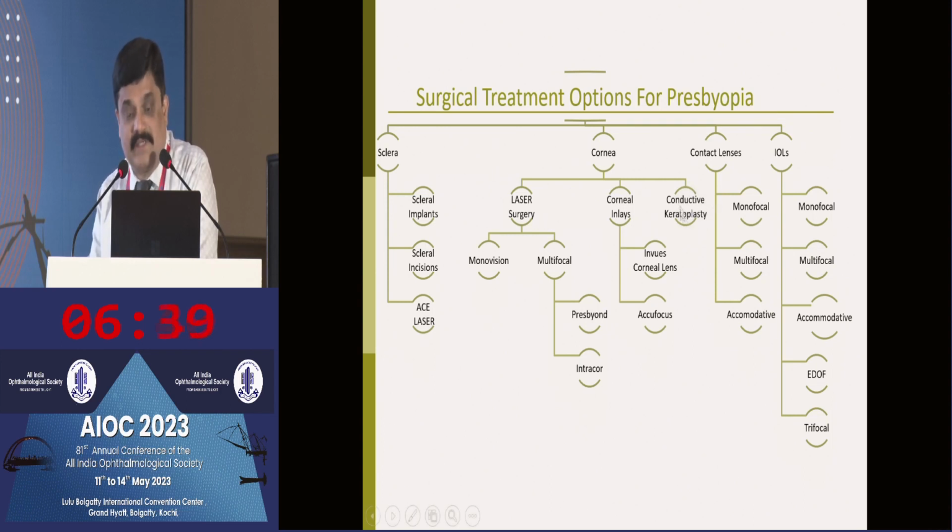People used to do even conductive keratoplasty. Even some of my friends still practice presbyopic contact lenses. Coming to the IOL, there are a lot of IOLs in the market. Probably the most common one nowadays is the trifocal and EDOF lenses.